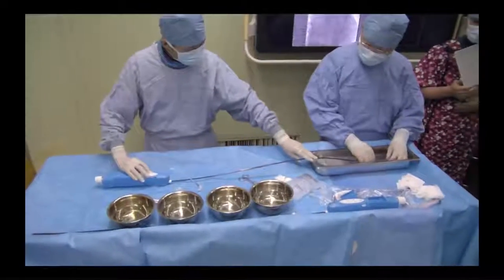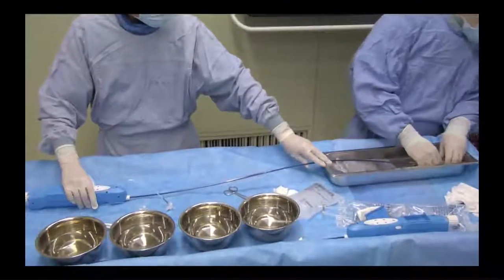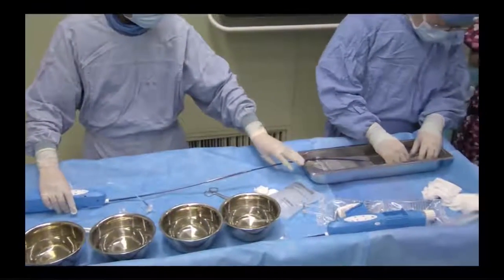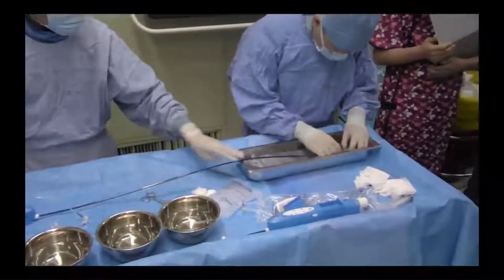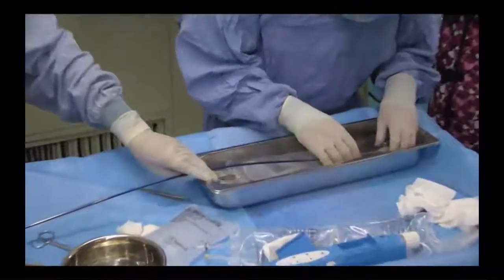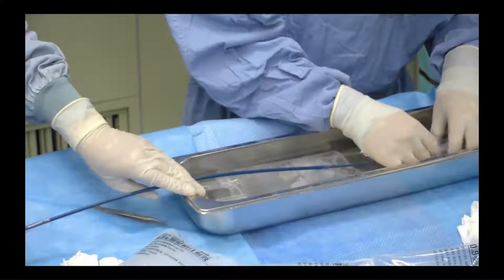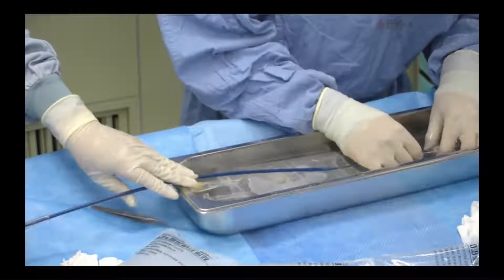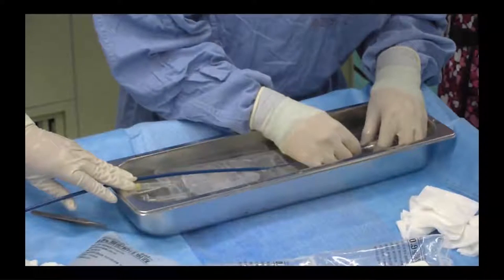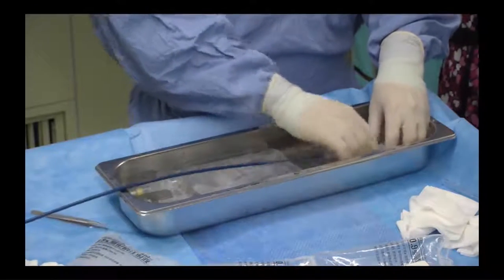Now, if it's too small, I guess you can still put a Sapien inside it. Make it bigger. Do you think there's really any advantage of using a motorized release? I don't know how that's designed. Is it just really pulling back, or does it give back some, sort of a clutch almost?